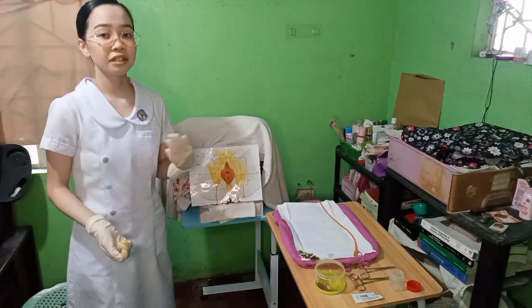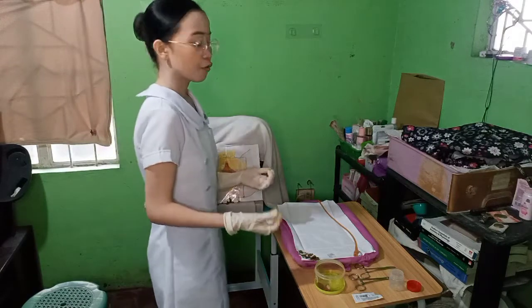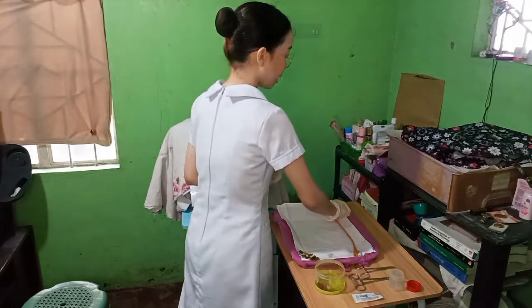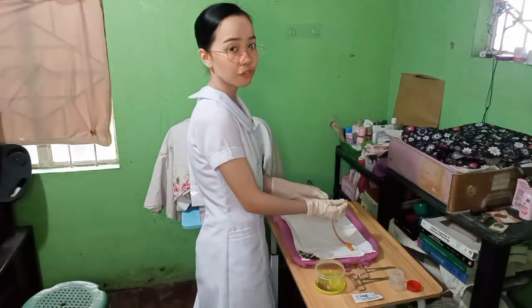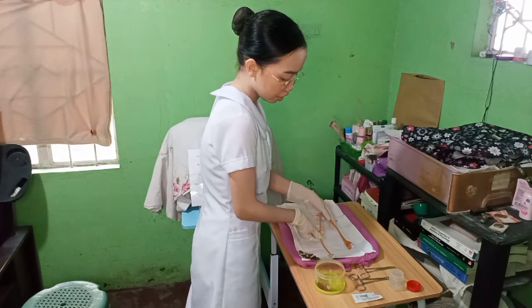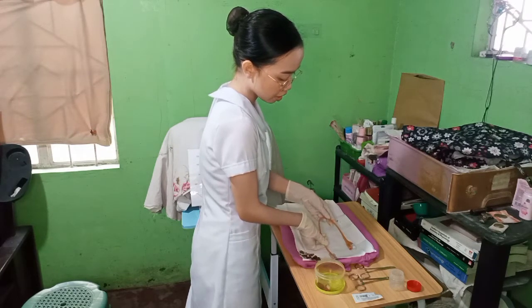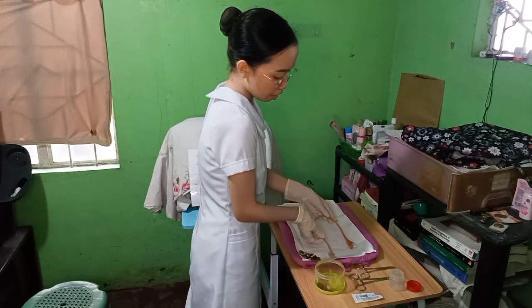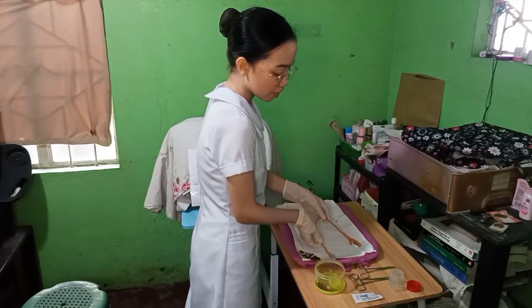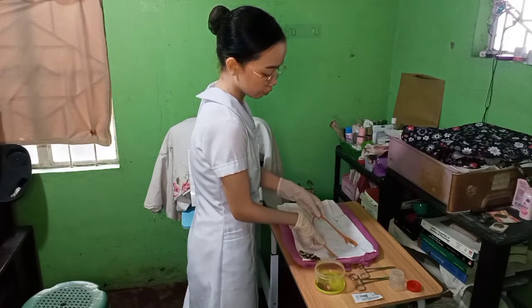After performing the perineal care, we'll proceed in performing straight catheterization. So first, pick the catheter using your dominant hand and then apply an ample amount of water-soluble lubricant at the insertion tip of the catheter, about 5 to 7 centimeters or 2 to 3 inches. Using a sterile aseptic technique, lubricant facilitates the insertion of the catheter.